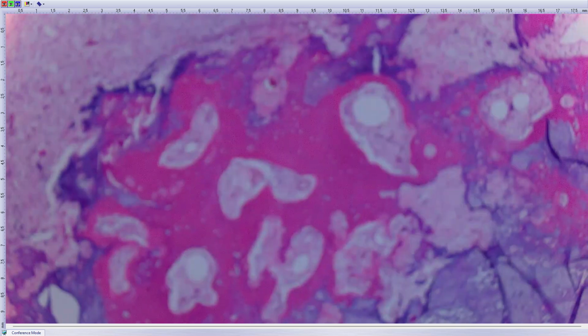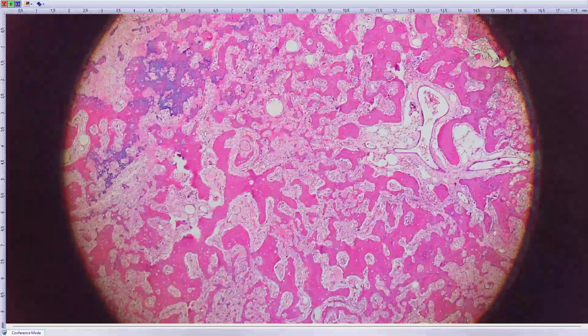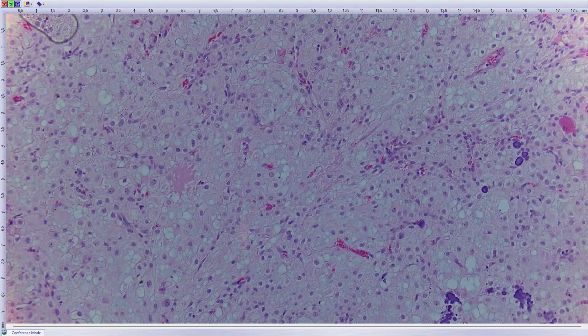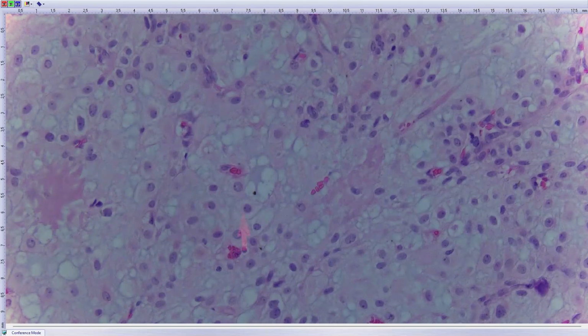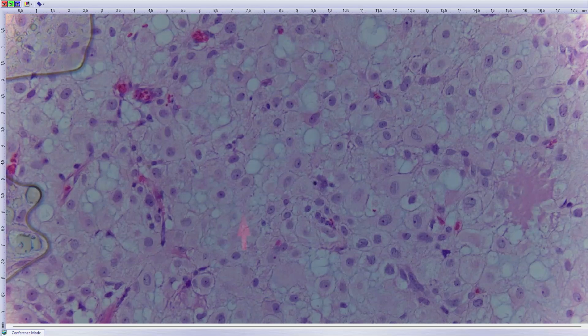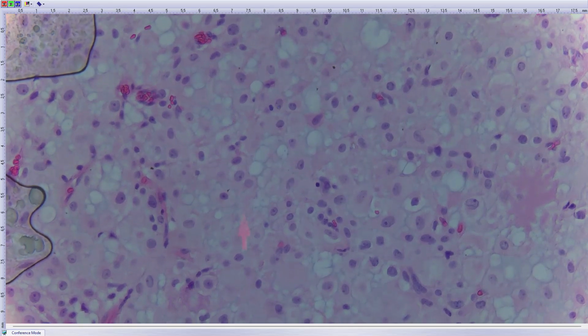The rarest chondrosarcoma subtype. It's a special subtype of chondrosarcoma. It's genetically completely different from the conventional chondrosarcoma. This is important to mention, and it's very rare. This is another example of the same tumor. It's an old slide, so there are bubbles, but still you can see areas with pretty much the same morphology as we saw before. Another clue, besides the clear cell cytoplasm, is this very prominent cytoplasmic membrane, which you can see in most cells. So clear cell chondrosarcoma, and that's my last case to show you.